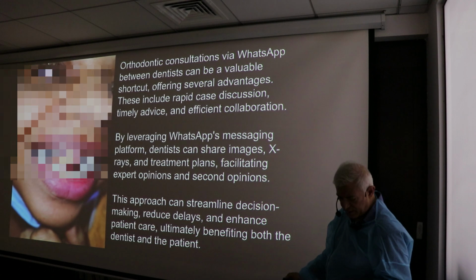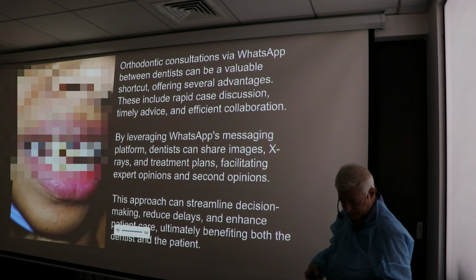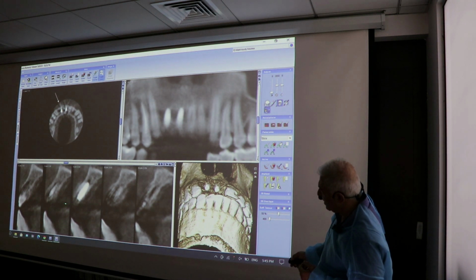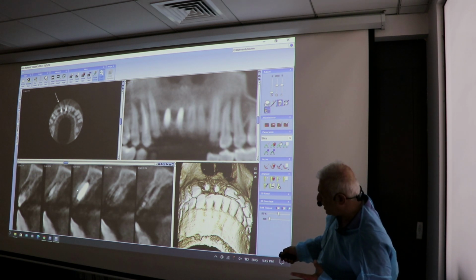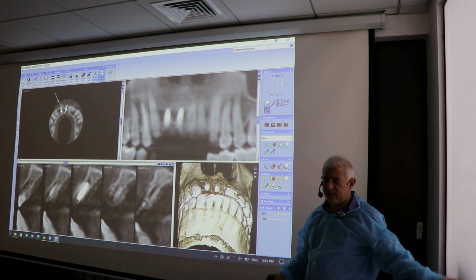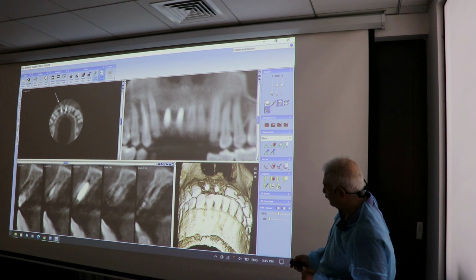I wish the volume was there, to show you how fast we could communicate with the orthodontist about this case. Now, if this is good news for you or not, but I think this was the best possible position of the implant at that time. Now, the reason why this is bulky, and it was not bulky before I placed the implant, is because I didn't drill. I just made the first hole and I started using expansion.